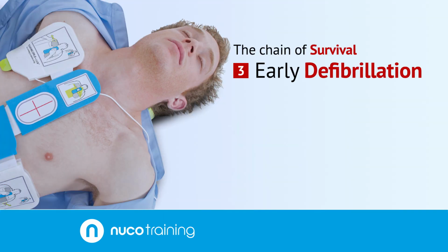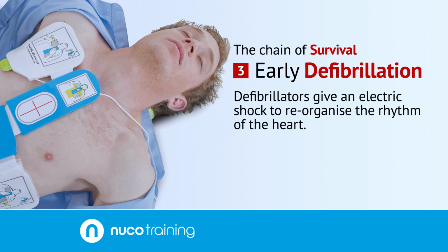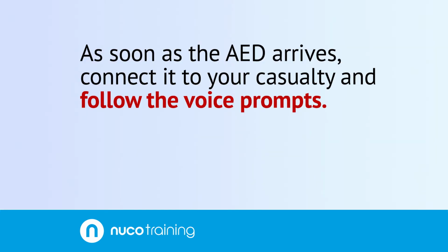Early defibrillation. Defibrillators give an electric shock to reorganise the rhythm of the heart. Defibrillation within 3 to 5 minutes of cardiac arrest can produce survival rates as high as 50 to 70%. Each minute of delay without defibrillation reduces the probability of survival to hospital discharge by 10%. As soon as the AED arrives, connect it to your casualty and follow the voice prompts.